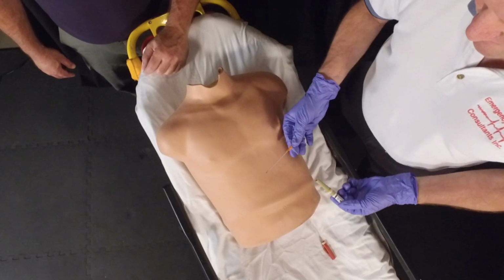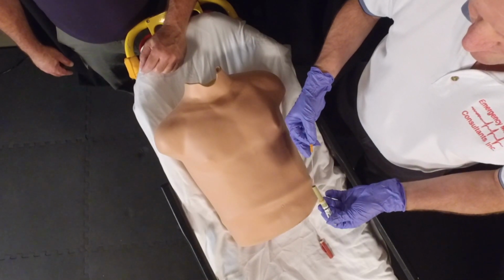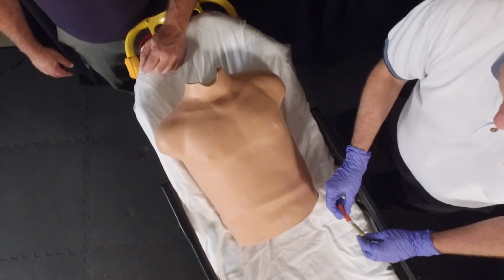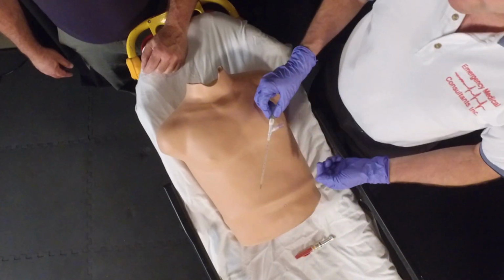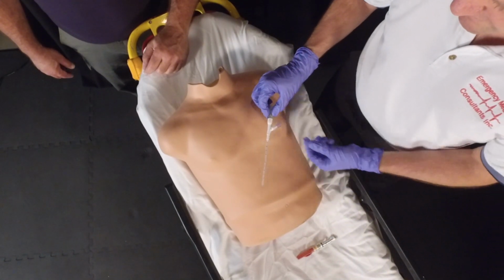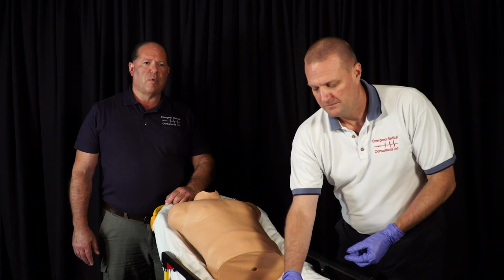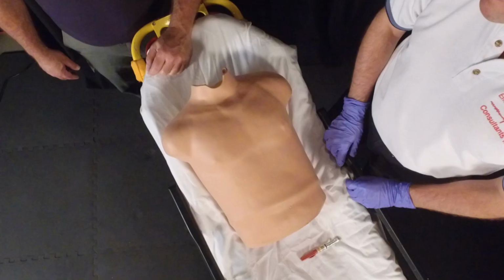As we perform the procedure, remember what you need is a 14 gauge, 3¼ inch needle at minimum. We've realized over the past several years that that's the standard needed to get through the pleural cavity on most patients. Recently, we've seen the advent of several 12 gauge or 10 gauge devices with a built-in valve that you may see used in some areas. We're just going to demonstrate the standard 14 gauge catheter going through the pleural cavity to decrease the tension pneumothorax at this time.